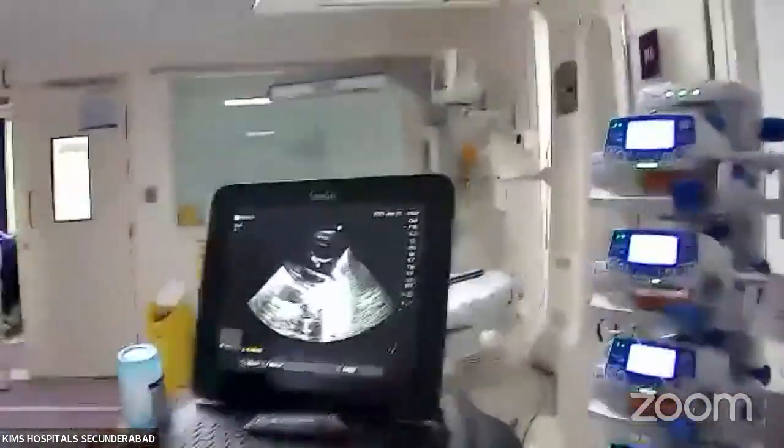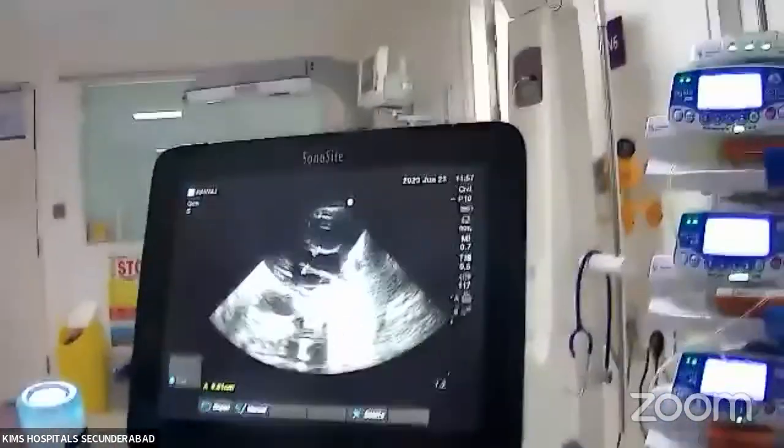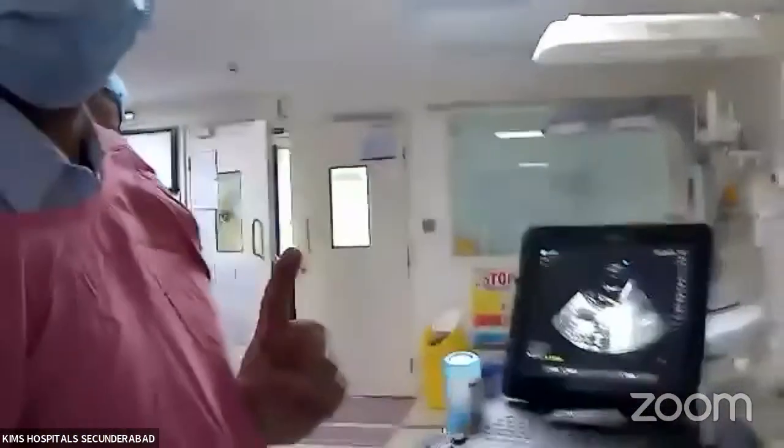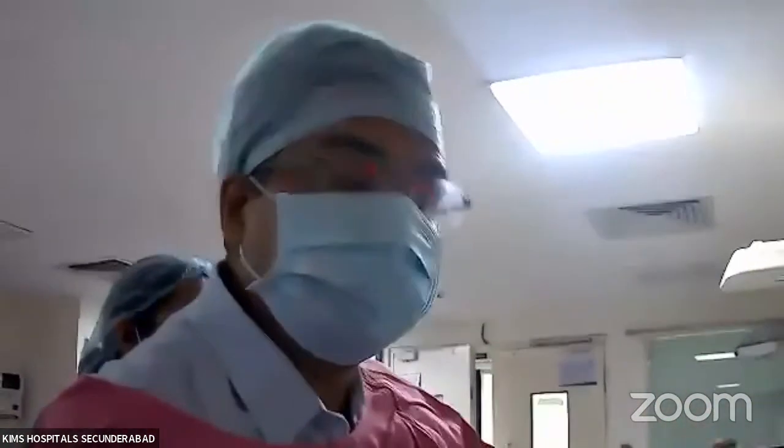This is the caliper. This we are seeing as the annulus of the aorta, that means LVOT, that means coming 6. So what will be the radius? 3. So pi r square. Okay, that means this is the area of the LVOT.